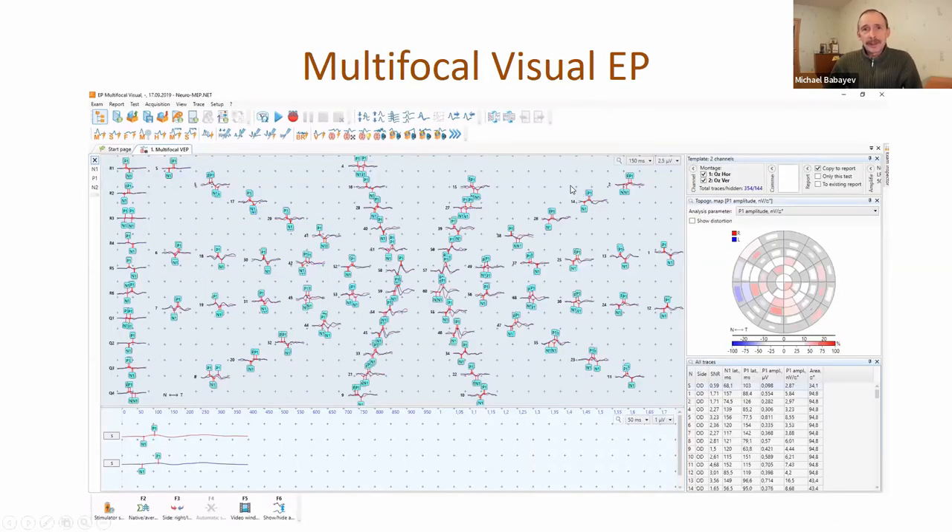Multifocal visual evoked potentials. You may know that some time ago we realized multifocal electroretinography, with which it's possible to create a topographical map of retinal sensitivity. In this multifocal visual evoked potential test, we can create a topographical map not only for the retina, but for the full visual pathway that includes the retina, visual nerve, and visual cortex.